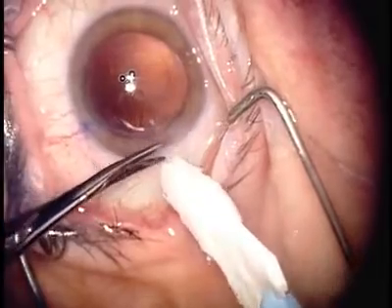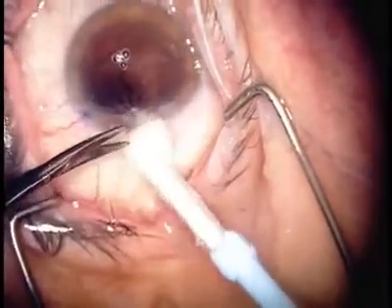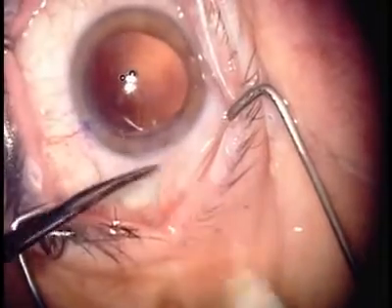So the important lesson here is to close the chamber, to use a separate paracentesis for the anterior vitrectomy instrument so you have good control of the chamber.